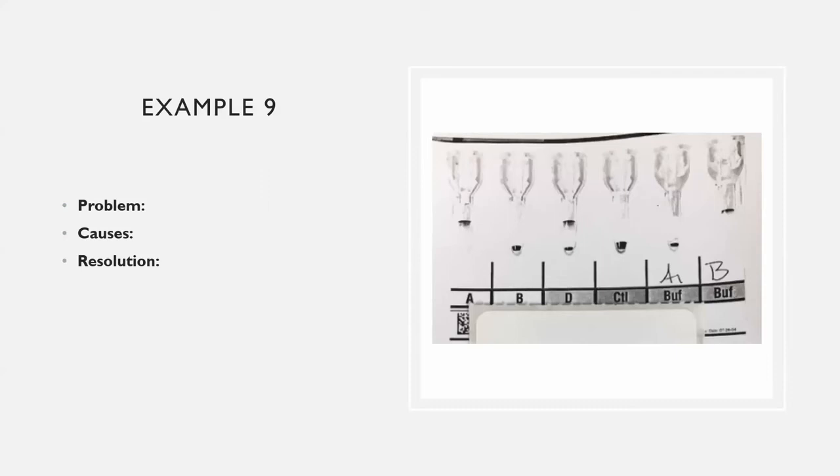Yeah, it does. So it's not an ABO discrepancy. Remember, D is not part of ABO. So no ABO discrepancy, but you do have a mixed population. So a D negative person could have got transfused D positive cells or vice versa.